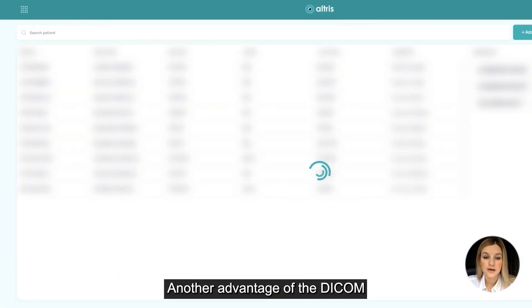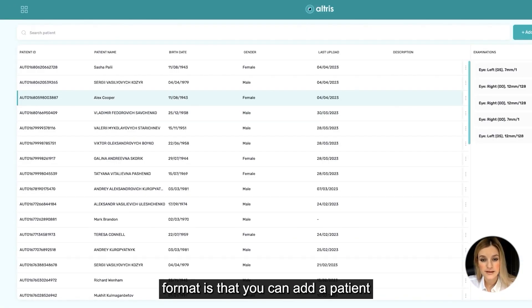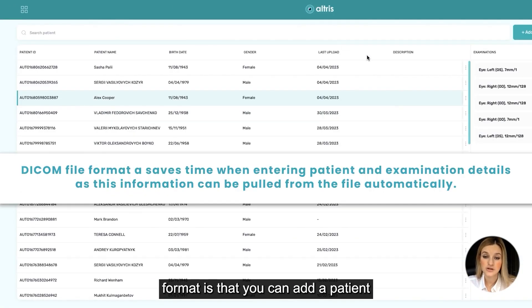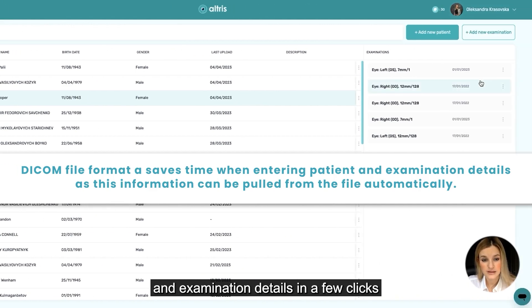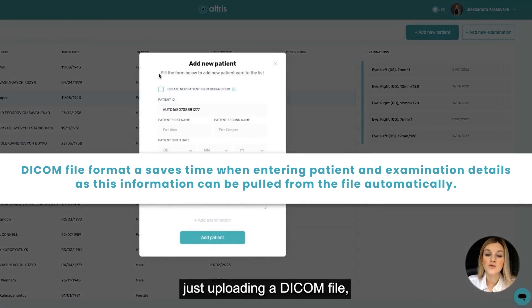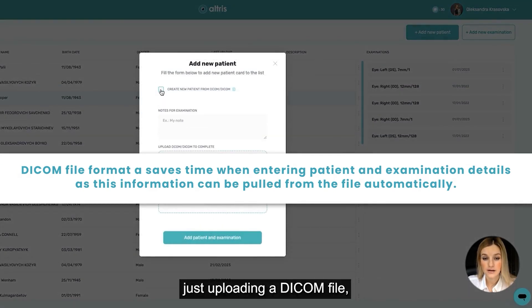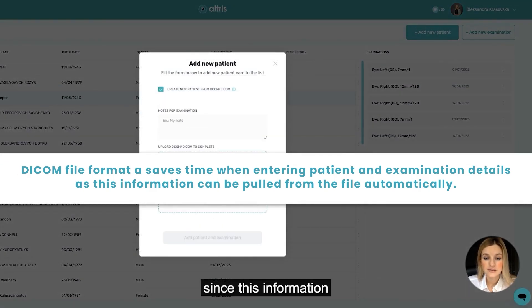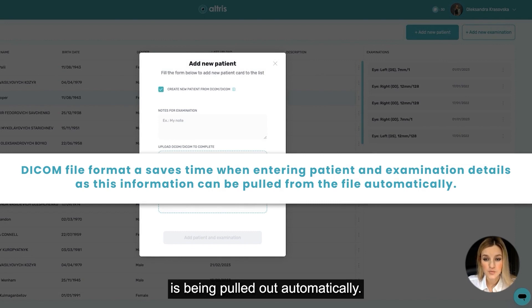Another advantage of the DICOM format is that you can add patient and examination details in a few clicks just by uploading a DICOM file, since this information is pulled out automatically.